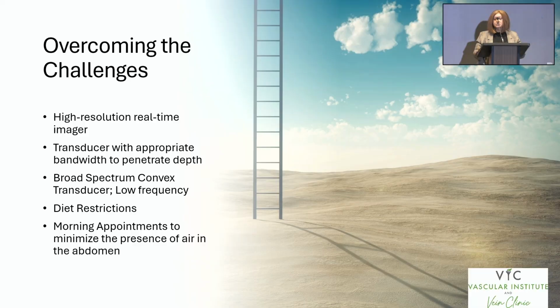The more tissue it has to travel through, the more attenuated the signal. So turning the patient on their side, coming in from that flank view or the decubitus view can sometimes give you great images when you weren't able to get them with the patient supine.